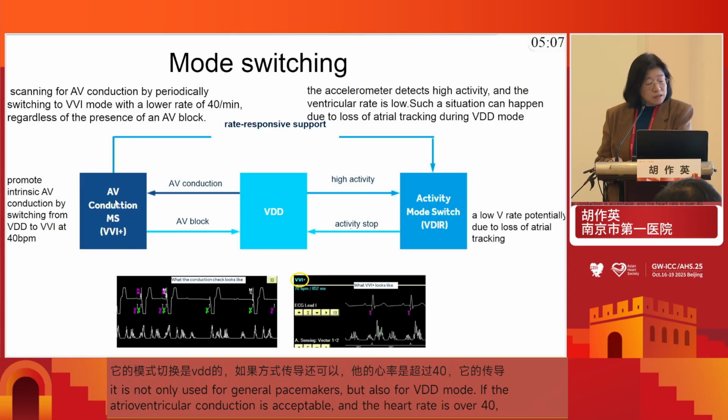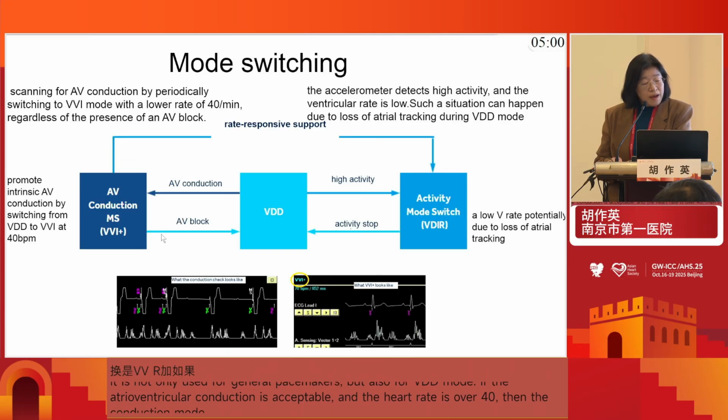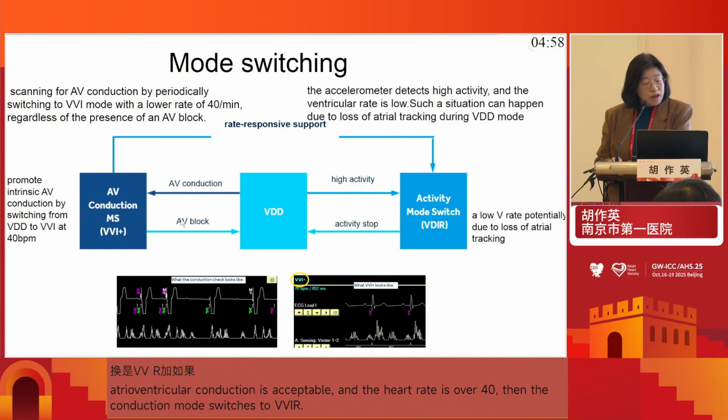If it is conducting, it can be transferred back to the VDD if the AV block happened.